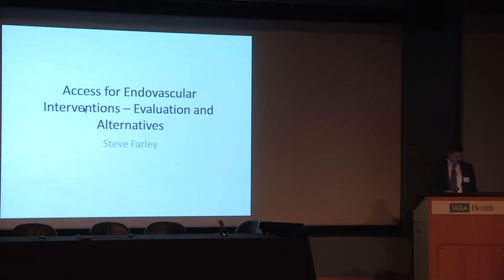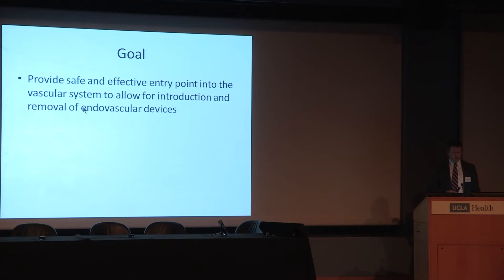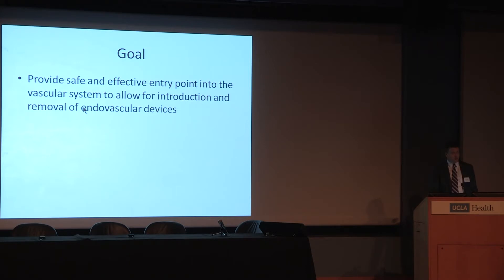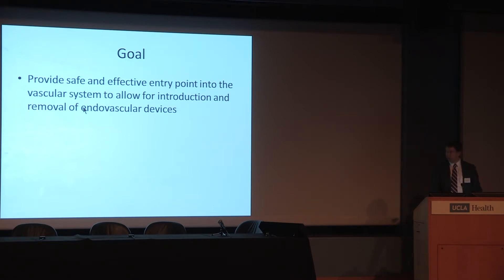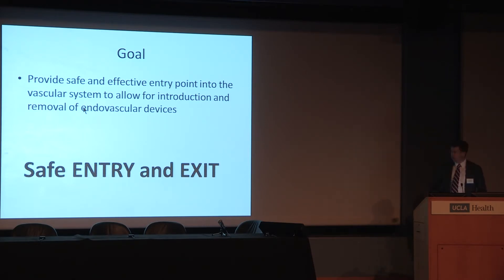My topic is access for endovascular interventions — evaluation and alternatives. The goal of access for proceeding with endovascular repairs is to provide a safe and effective entry point into the vascular system to allow for the introduction and removal of endovascular devices. I added removal because that's a lot of times where the problem occurs. You've gotten to the prize, you've done the procedure, but then you can't get out of trouble. So again: safe entry and exit.